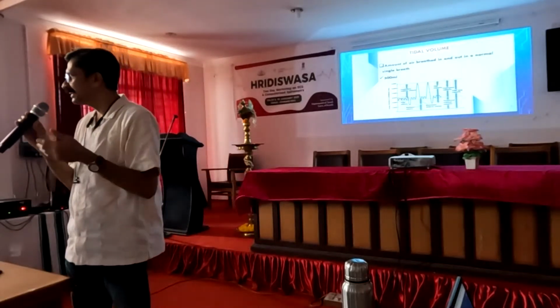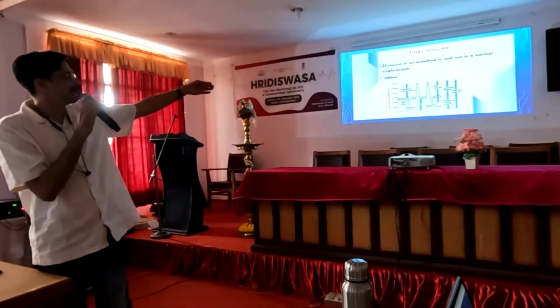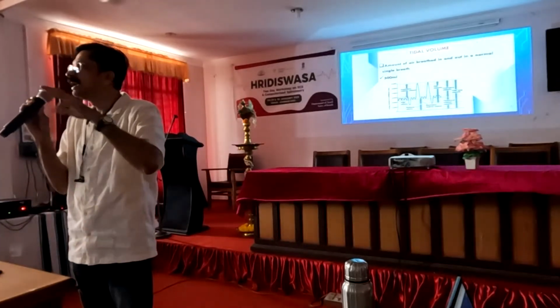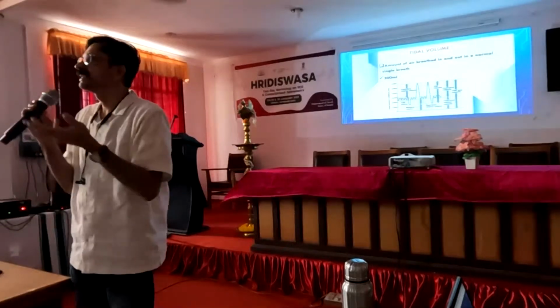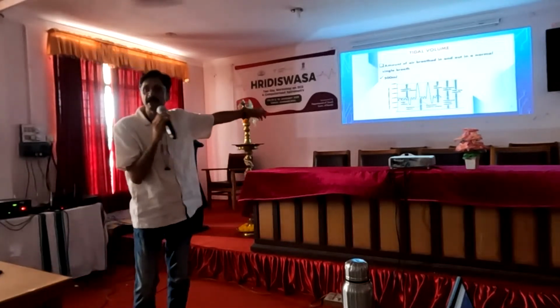Simply sitting and taking normal inhalation and exhalation. That is the amount of air breathed in and out during normal quiet breathing. Simply sitting, we are taking inhalation and exhalation. The normal amount of air that we are taking in and out during quiet normal breathing, that is tidal volume.